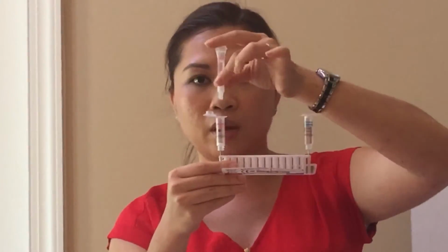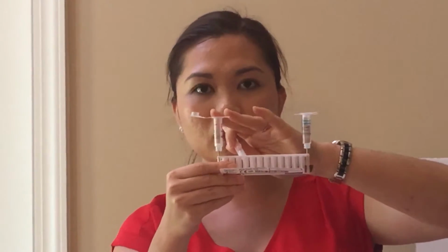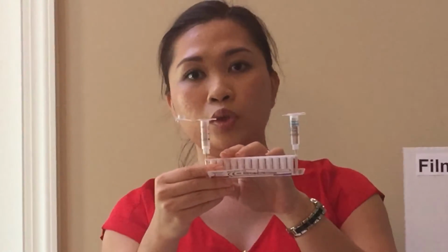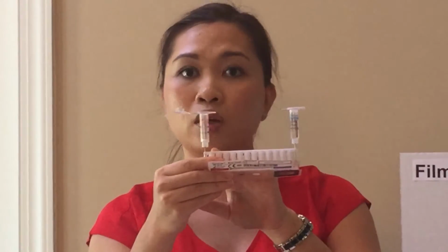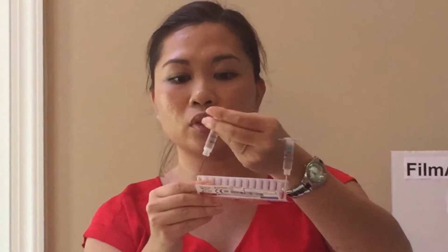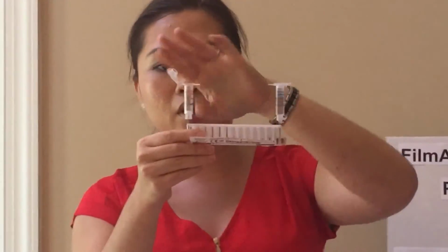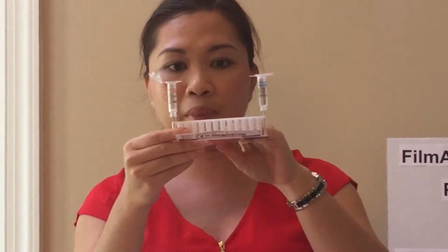Gently squeeze the whole sample buffer vial onto this area, along with 0.2 ml of the positive blood culture from the patient's blood culture bottle. You're going to close it, mix it 3 times, put it back in, close this one, push it hard so the fluid gets drawn onto the pouch.